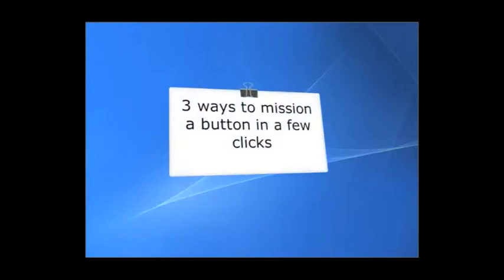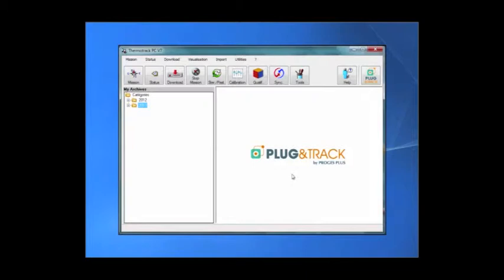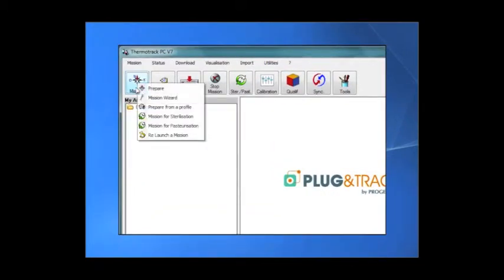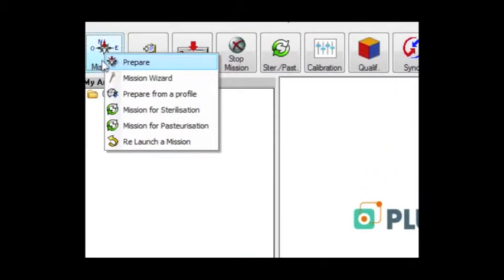There are three ways to mission a thermobutton. With this first one, you can choose all parameters, click the mission icon and choose prepare.